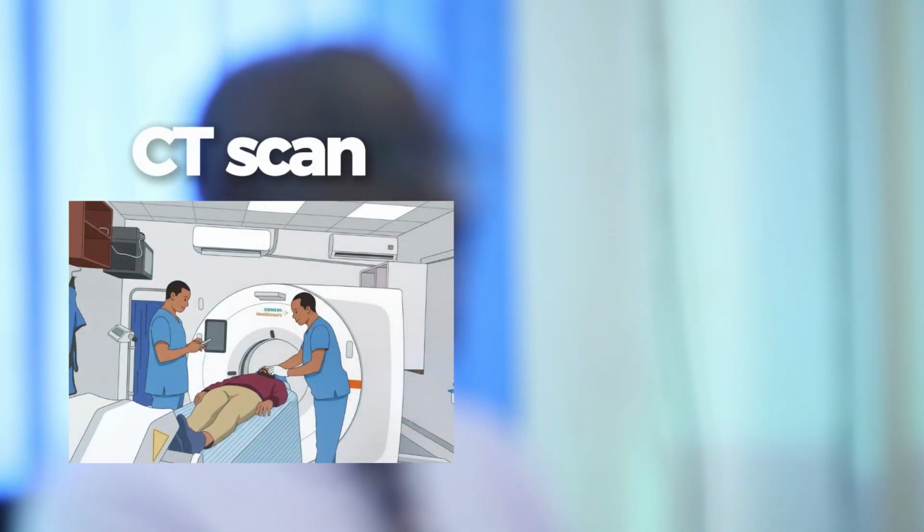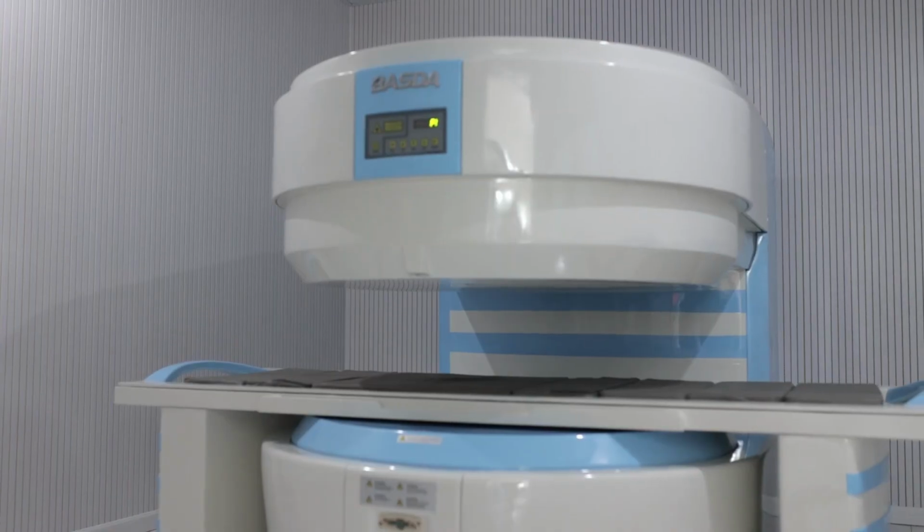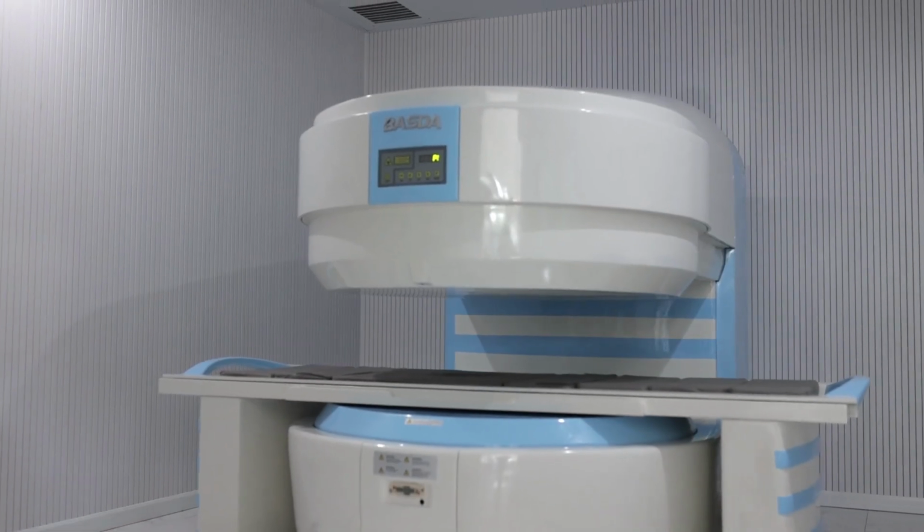For today, we are going to look at two modalities, comparing the CT scan and the MRI. A lot of you have been asking, now that we have a lot of advancement in MRI, do we need a CT scan? But probably before we go into the comparison, let's look at each one of them.